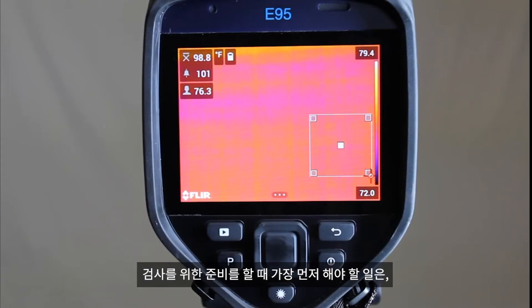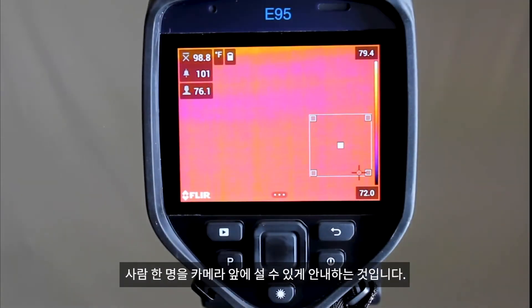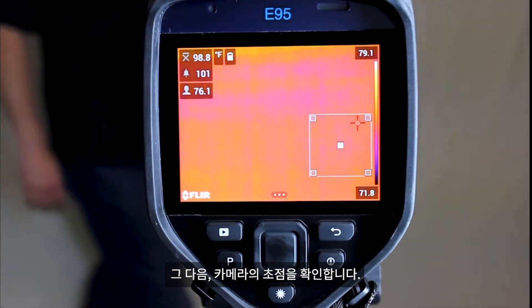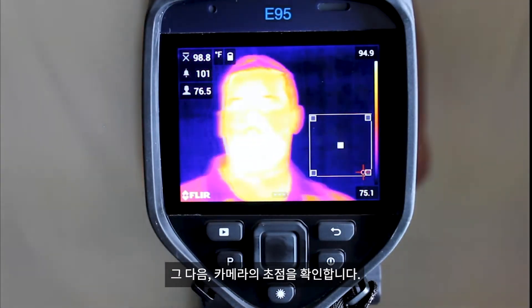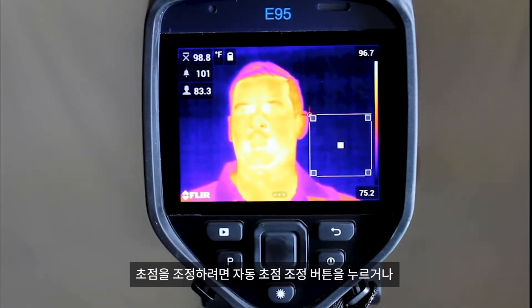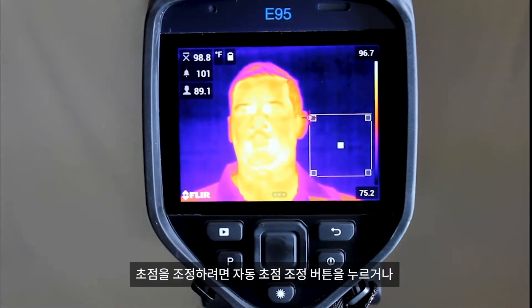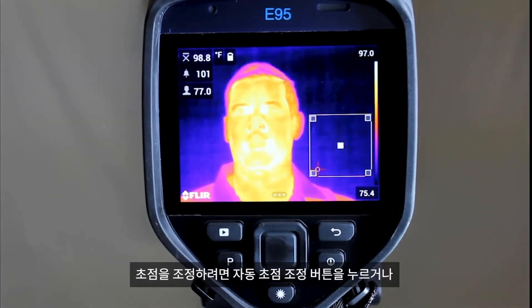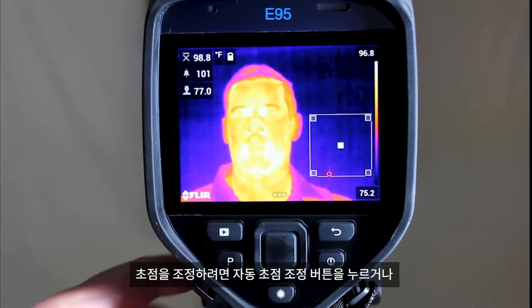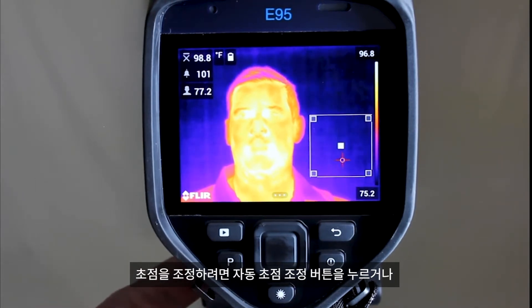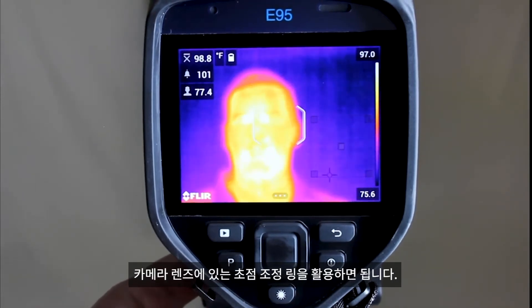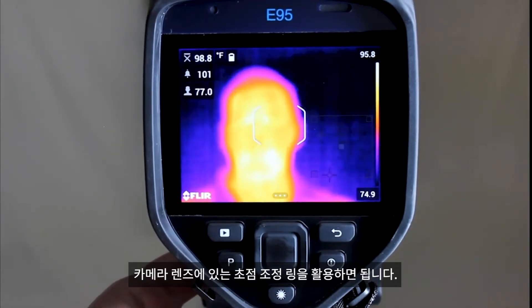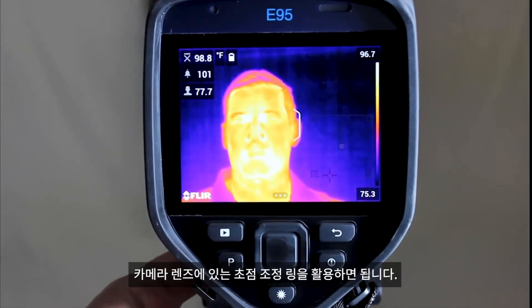When you begin the screening process, have your first subject move in front of the camera. Next, make sure the camera is in focus. This can be done by pressing and holding the autofocus button and using the manual focus ring on the camera's lens.